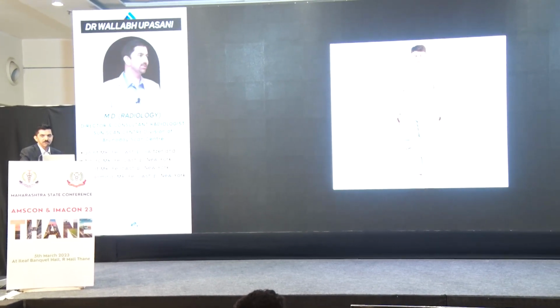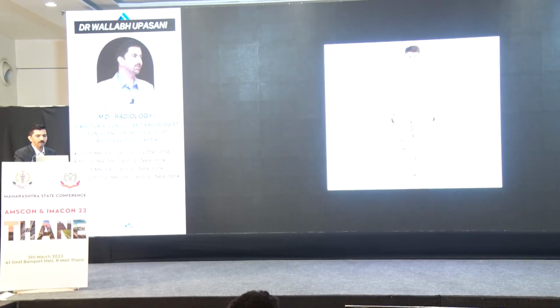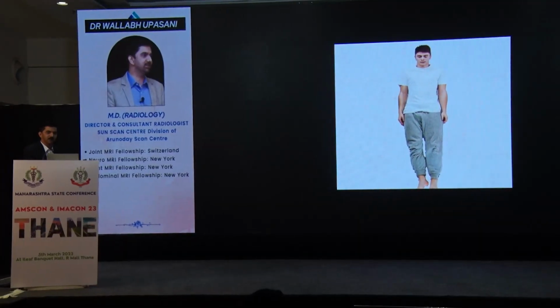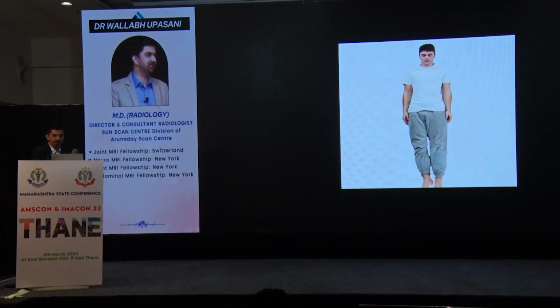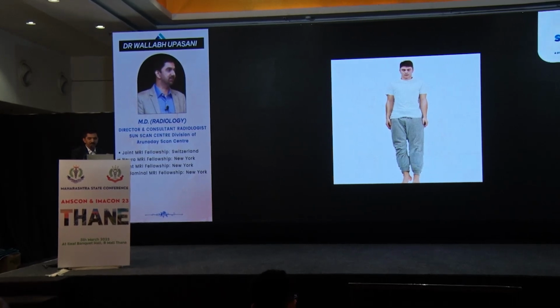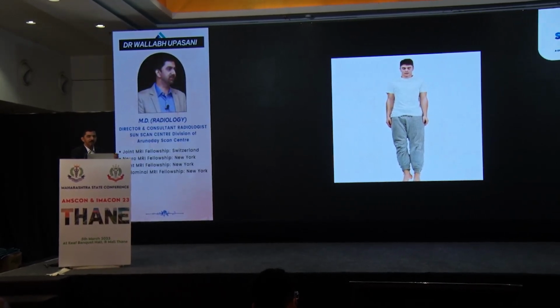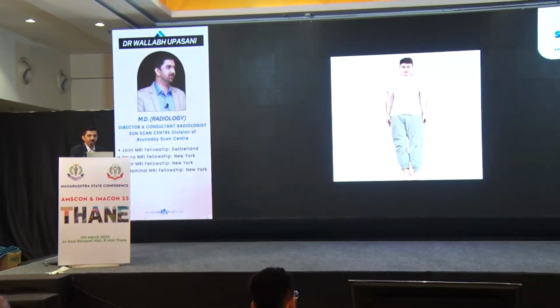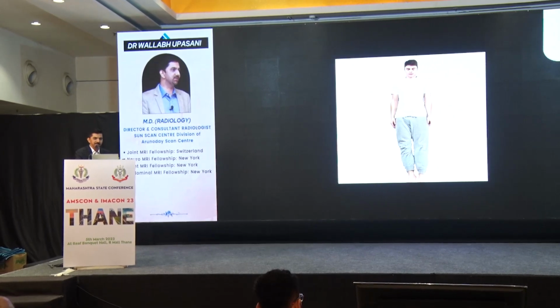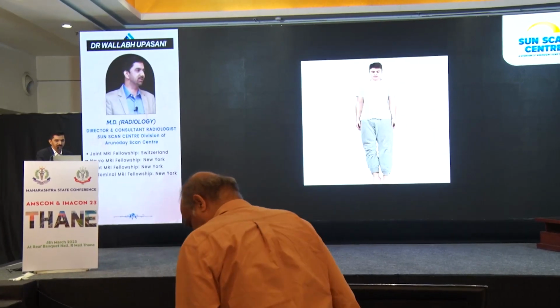Now this is a technique which we have not spoken about very often, that is dynamic contrast enhancement. All of us are aware that we give MRI contrast whenever we get a focal lesion. So what is dynamic contrast enhancement? Dynamic contrast is a procedure where we inject the contrast and acquire the MRI images at the same time. When we inject the contrast, we acquire multiple phases of the contrast in a very short time. We acquire almost 16 phases of the contrast in around 3 minutes.